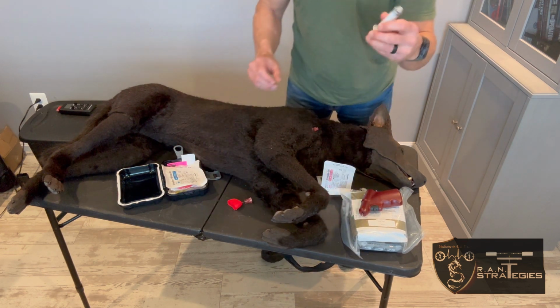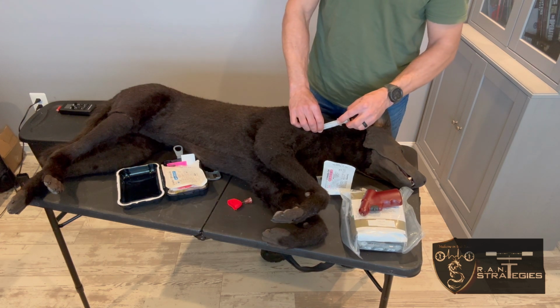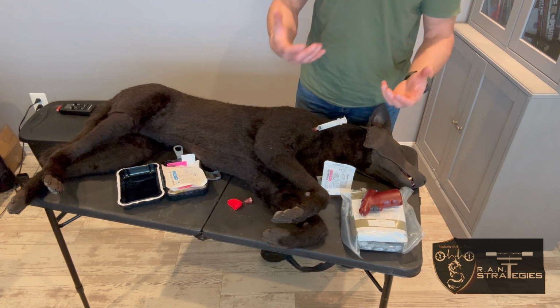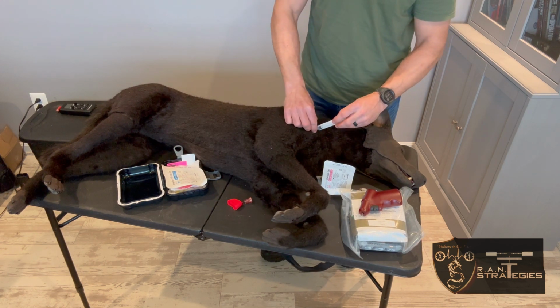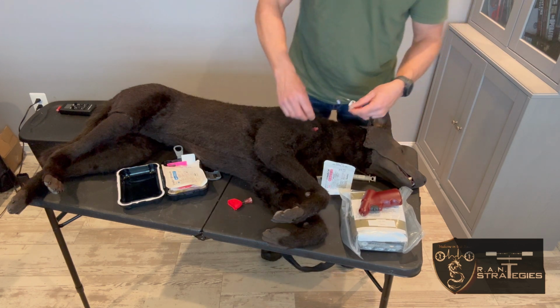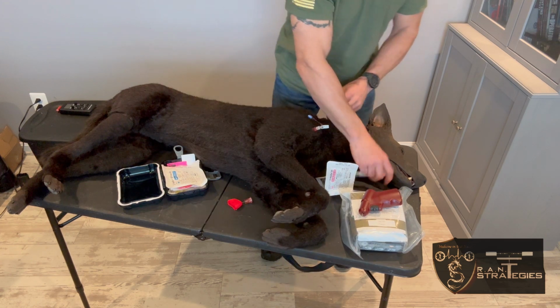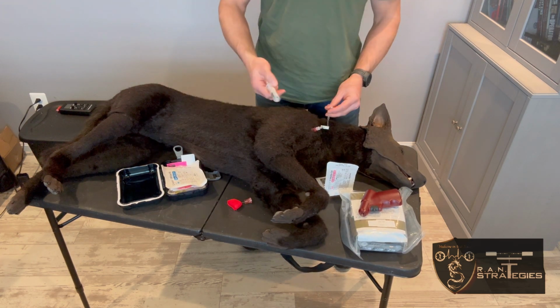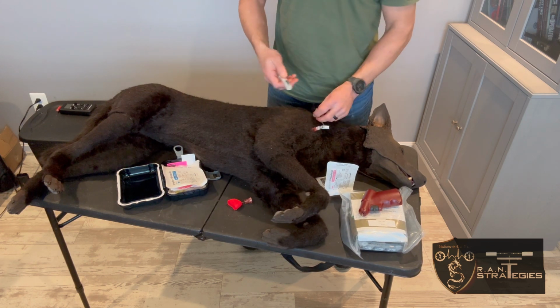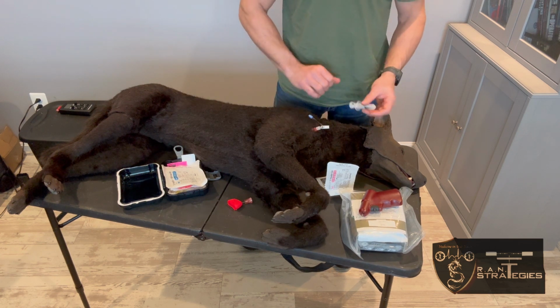Right from here, we want to take our empty syringe, apply it on, and then we're going to aspirate to confirm placement. And what we're looking for is a little bit of bloody bone marrow. Once we confirm our placement, we can remove that, attach our tubing set, and then from here, whatever medication we were going to administer or whatever fluid resuscitation we were going to start, we can do so right through the IO route. So this is site number 1.